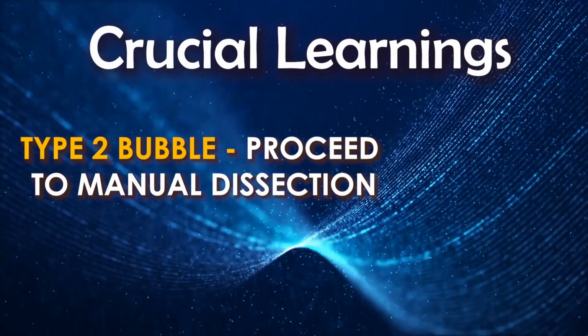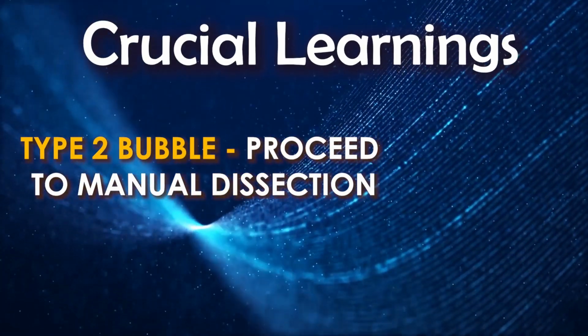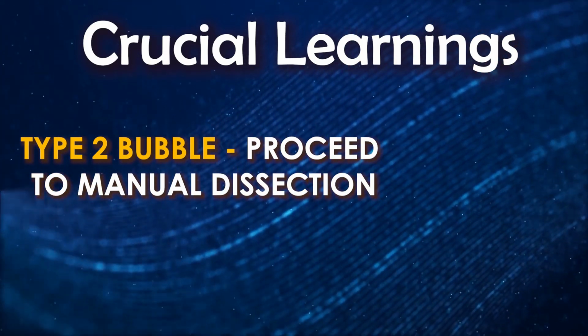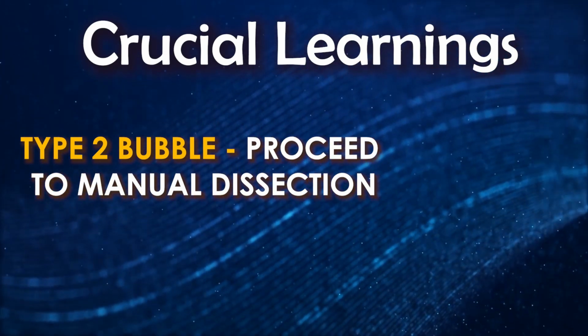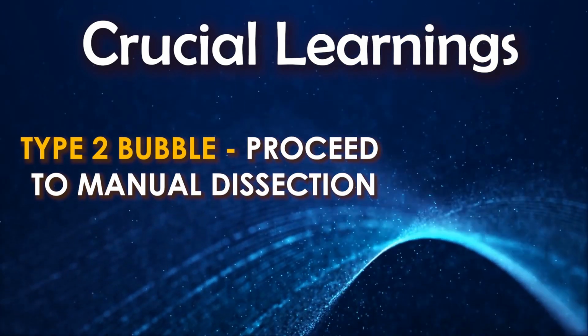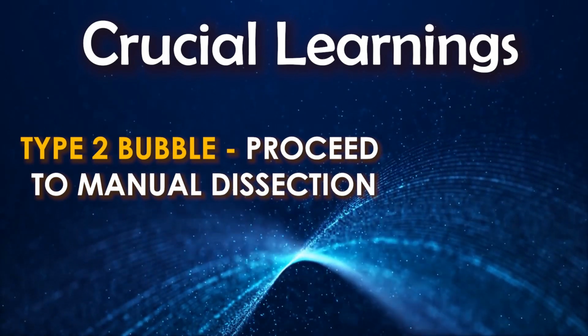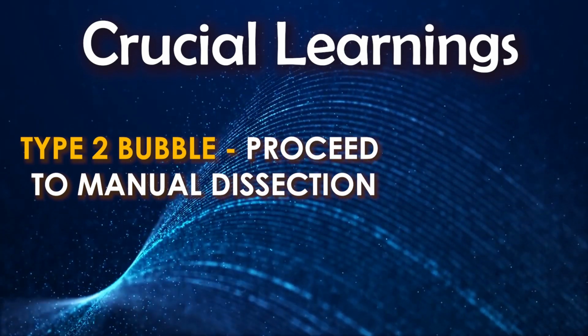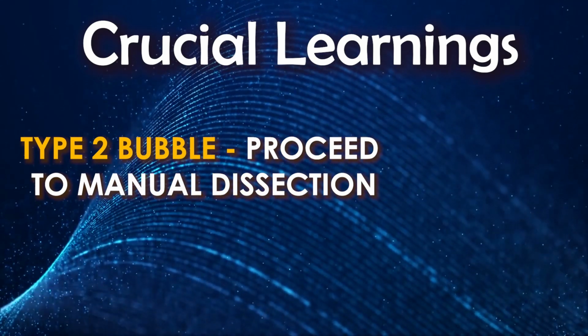Proceeding with the 4-quadrant stromal dissection when a type 2 bubble is achieved is risky, especially with beginners. Deflating the type 2 bubble and proceeding with the manual dissection is a good viable option for beginner surgeons to prevent inadvertent rupture of the bare Descemet and thus conversion of DALK to penetrating keratoplasty.